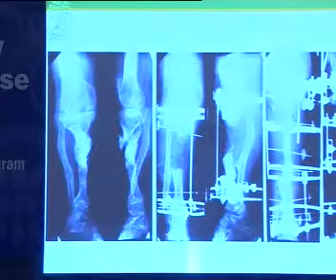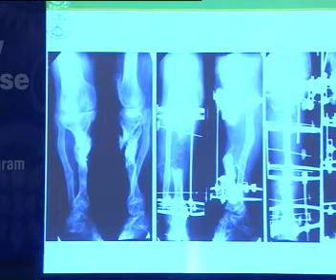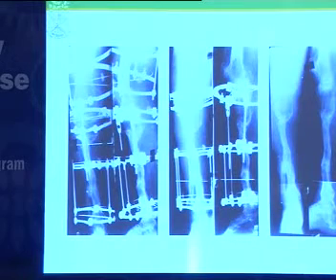Patient diagnosis with pseudoarthrosis of tibia, osteomyelitis, fistulography. Sequestral necroectomy of tibial fragments and fixation of tibia using Ilizarov apparatus. Reconstruction of tibia using fibula. 1.5 years follow-up. No fistula, bone integrity was restored. Fibula is hypertrophied.